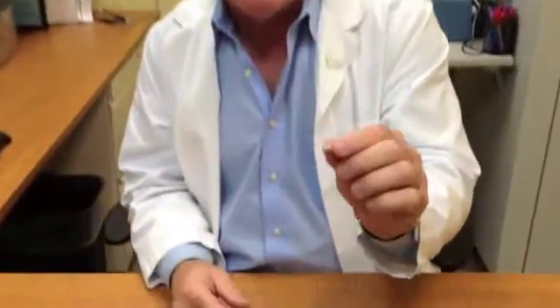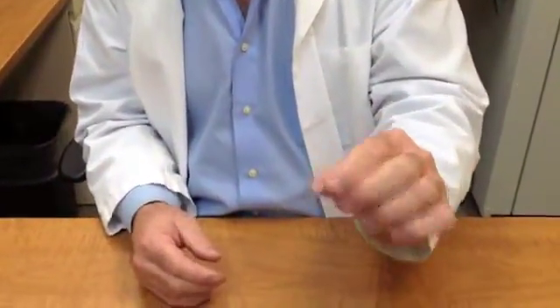For the people that don't have the dexterity issues and want the discretion, this is called a CIC. What that stands for is completely in the canal. So when you hear those acronyms, you'll know why we're talking about those. But those basically go completely in. And then, like I said, we have another model that is a deep fitted one. But you have to have really large size canals for that to basically work.